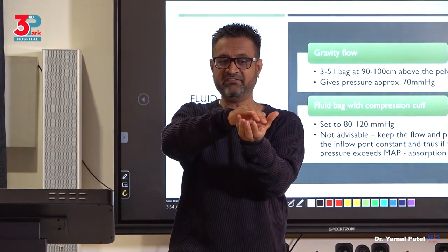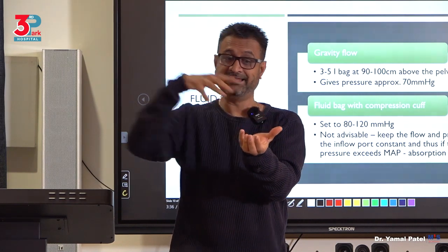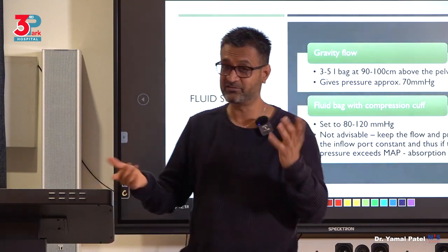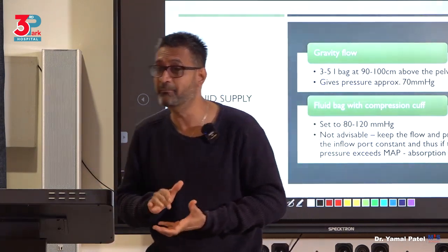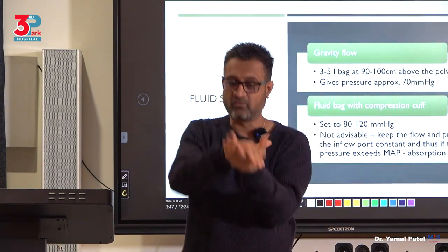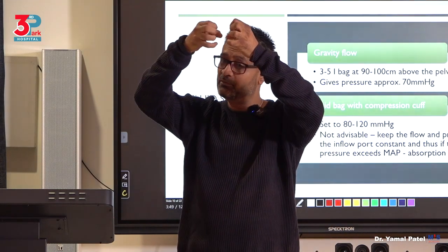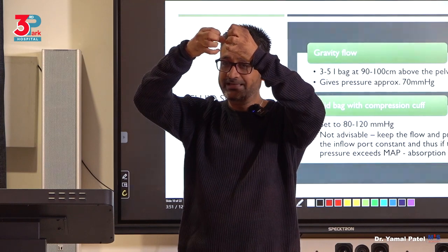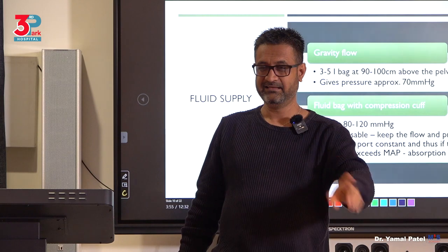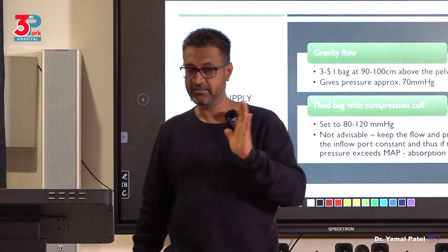Now, if this cavity is already distending and it's still distending, you are still pushing in whether the pressure inside there has reached or not, it is constantly still pumping in. And if you suck out or it's leaking and it's compressed, it's falling, this is still putting constant flow. It's not increasing the flow when the pressure down there has reduced. Are we understanding each other there, guys?